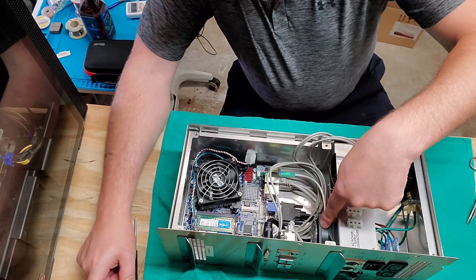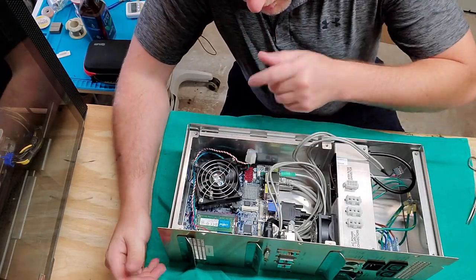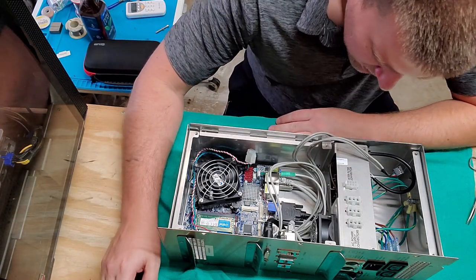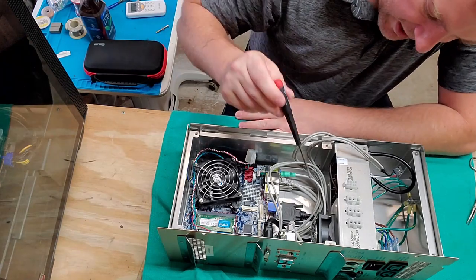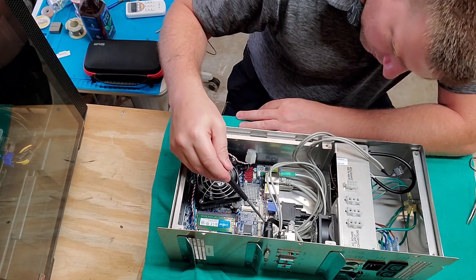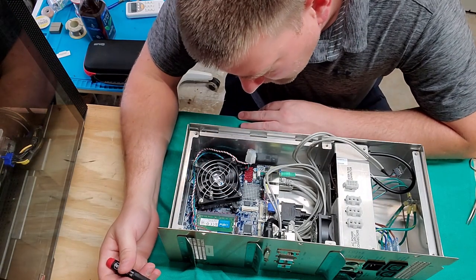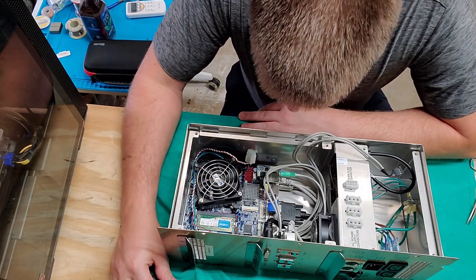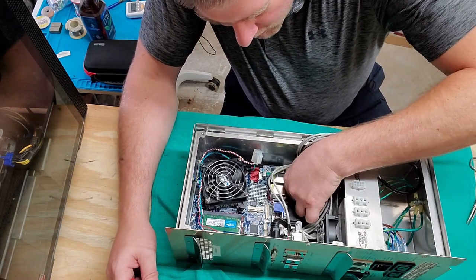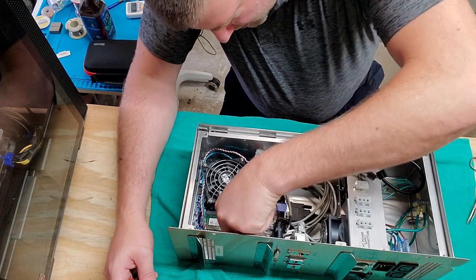So there's an auxiliary cooler right here, which is a little powered fan, which is plugged over here to the motherboard. Wow, that's a tiny little motherboard. Absolutely tiny. And it's going to be an older one because I have a VGA out, and right beneath it I have a DVI out. But over here, I've got two DisplayPorts. I was not expecting that at all. So I have DisplayPort out on this motherboard. Let's go ahead and check it out. I'm gonna go ahead and remove the motherboard completely from this case. I'm just way too curious about this guy.